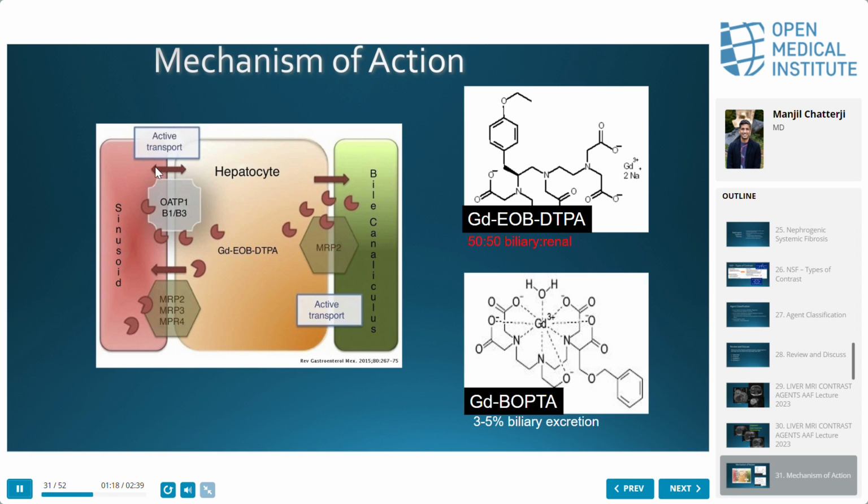Does that make sense? So in the case of an FNH, why is an FNH bright? Why does it retain? It has normal hepatocytes, so it's able to actively transport with OATP, but does a hamartoma of the liver, which is what that is, an FNH, when it's growing disorganized, do you all think it communicates with the bile system? No way. It's like the kidney. It comes up, and with it drags the ureter, its excretion, right? Liver is the same way.